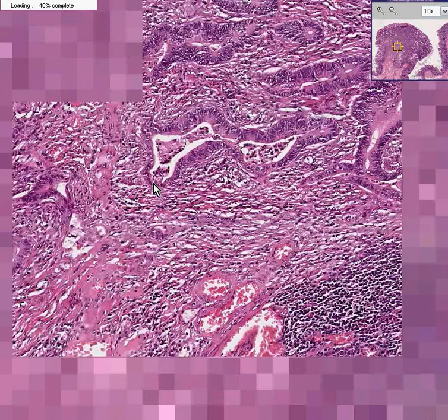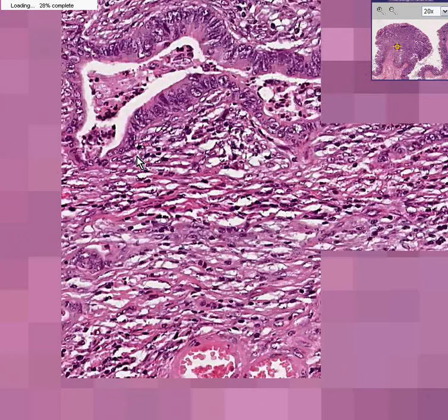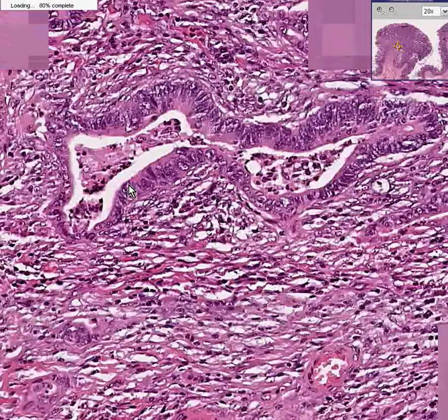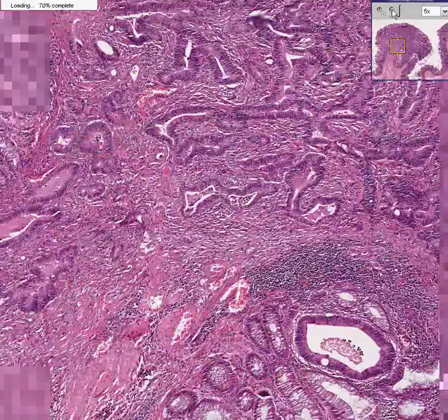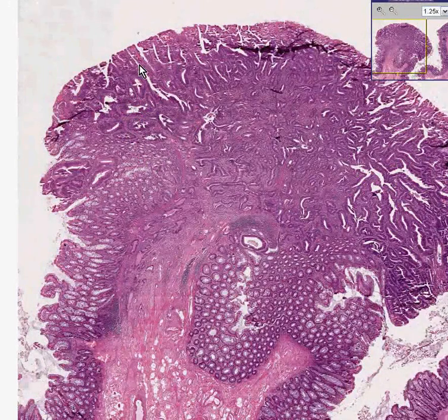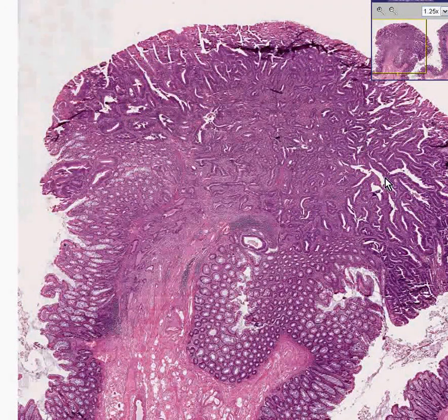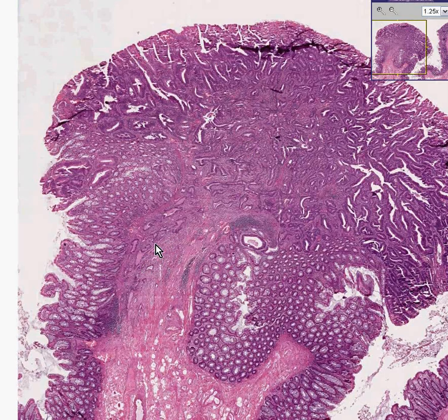So this is very, very clearly an example of irregular malignant glands from a malignant change with an adenomatous polyp now invading into the stalk. And let's see if we could get a lower power view of that, just to show you from a bird's eye view that even though you might describe these changes out here as being classically adenomatous polyp or tubular adenoma, somewhere along the line there's been a malignant change, and now some of these glands are infiltrating into the stalk.